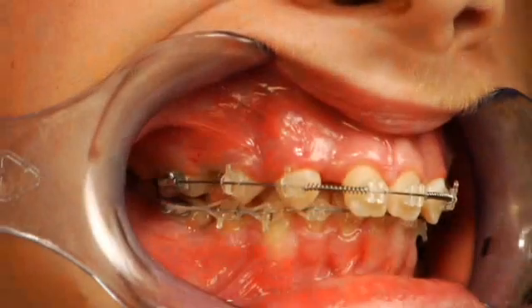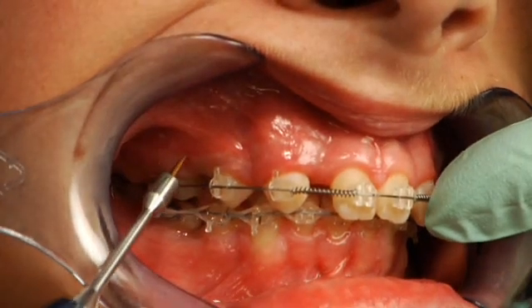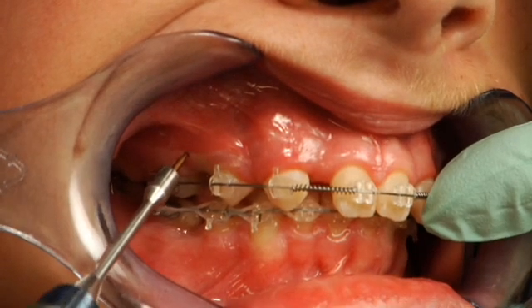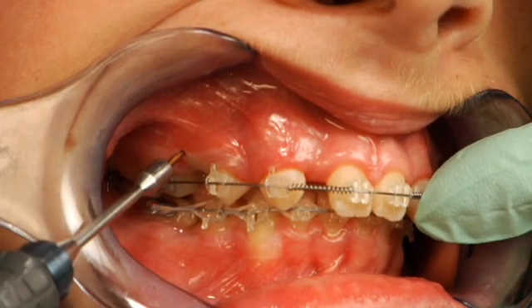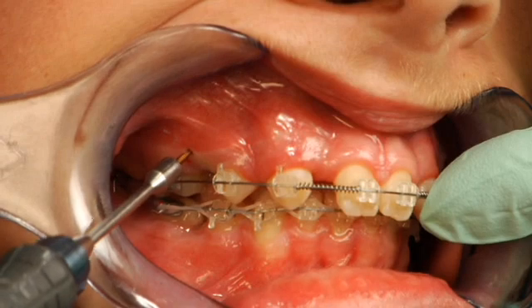Now we're going to place the mini screw. We position the tip of the screw just below the mucogingival junction and in front of the first molar. We have a slight angulation up. We'd like the screw head to be relatively flush with the cortical bone.